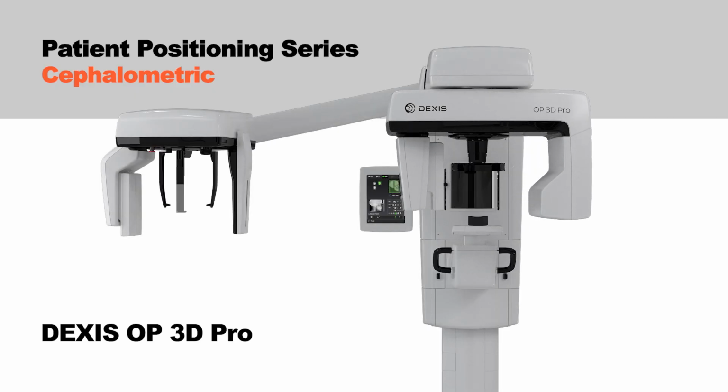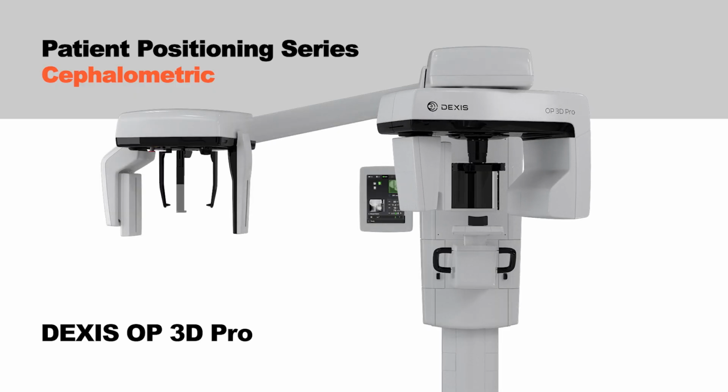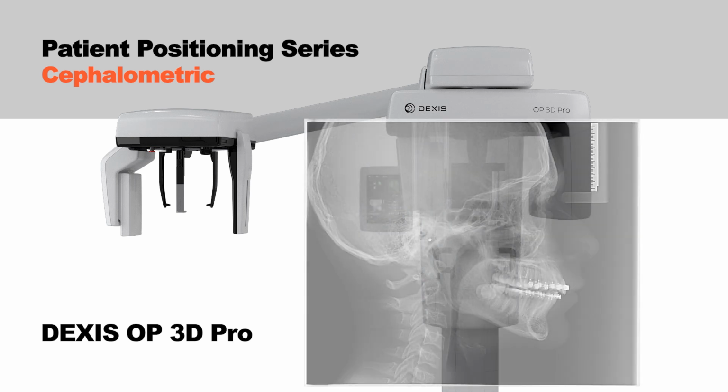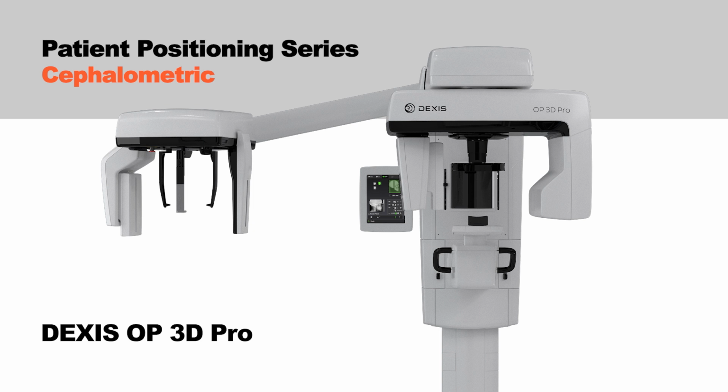Hello and welcome to a DEXIS OP3D Pro training video for acquiring cephalometric radiographic images. This video covers patient positioning, projection selections, and acquiring an image. If you have yet to do so, you may find it helpful to refer to the DEXIS OP3D Pro panoramic positioning video before viewing this video. To select a specific topic, use the seek bar on this video.